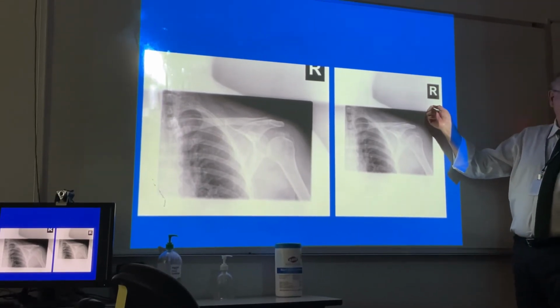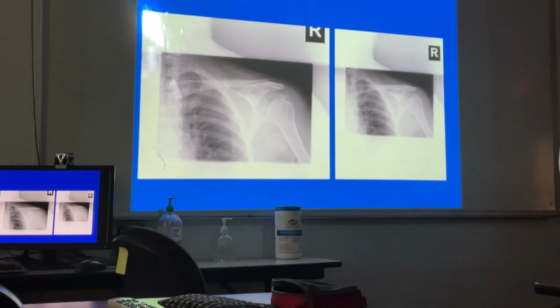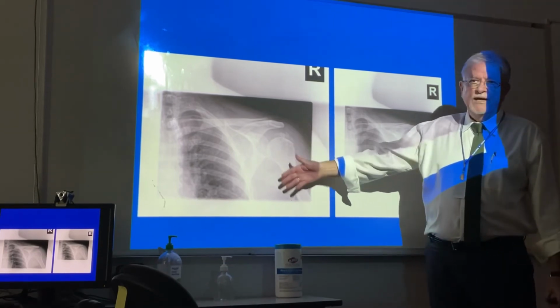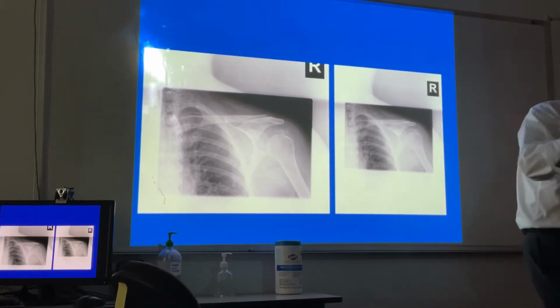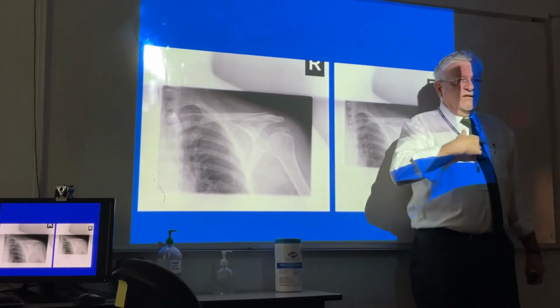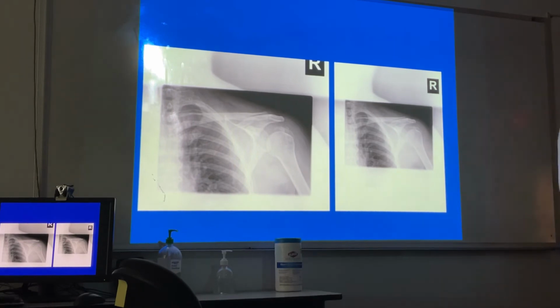Now, if they didn't follow our protocol, this could be mismarked. Now, how do I solve that problem? Take another X-ray. I don't see the heart shadow, so there goes my left standard marker that I could use. If you didn't take the X-ray, you're going to have to call the office and ask how the patient was positioned. Was their chest facing the X-ray tube, or was their chest this way? In other words, we've got to find out what it is.